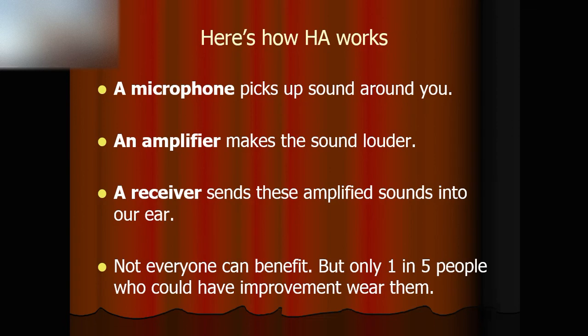How much to enhance? Which frequency to enhance? These decisions depend upon our hearing test results or audiogram. This is why an accurate audiogram is the first step to have a good matched hearing aid for us.